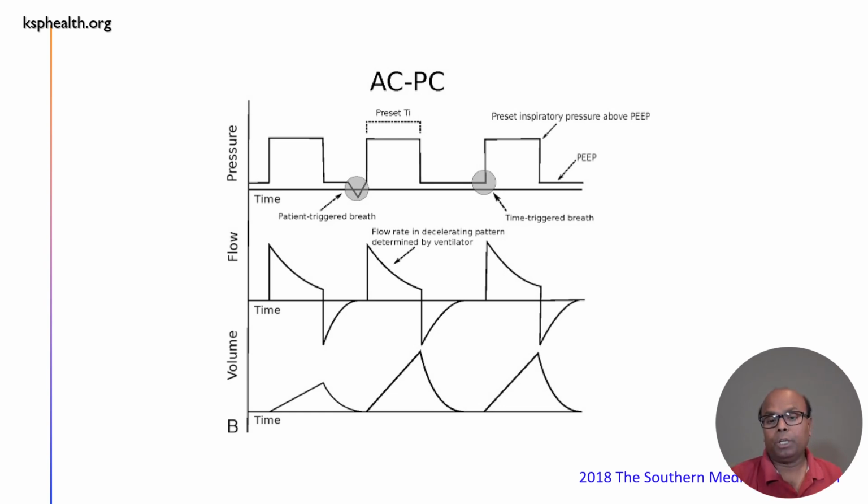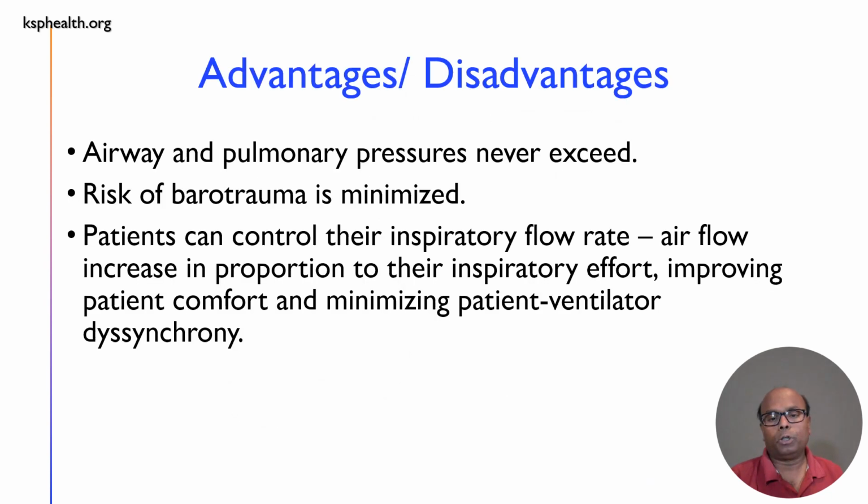When the time trigger breath, the same preset pressure is delivered to the patient. Because of the change in the compliance, the delivered volume changes. So whenever you preset pressure, make sure you monitor the volume.